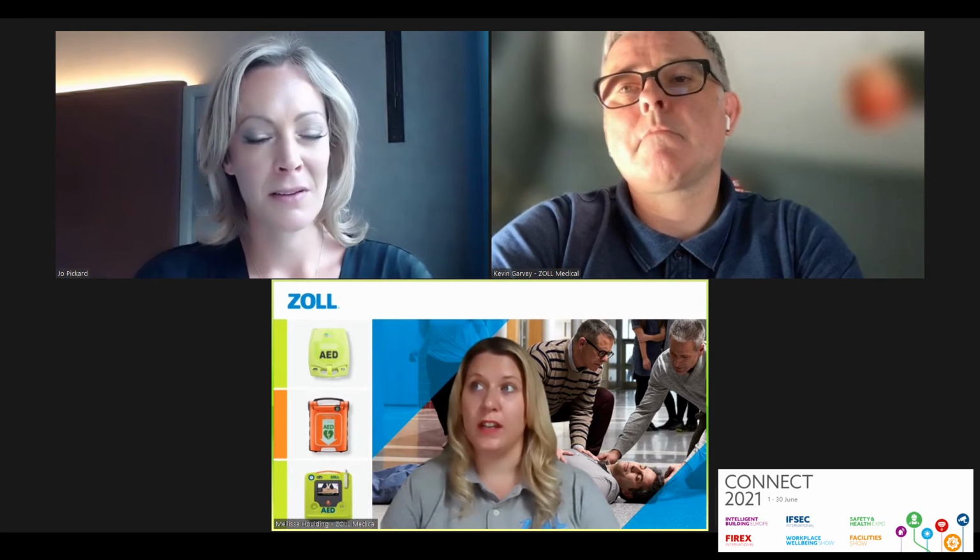When we're talking about servicing, that's usually if something is actually going wrong with the device, and the unit will tell you that there's something wrong, and then you can get in contact with the likes of ZOLL, for example, or a business partner that you may be working with, who can arrange to come and ensure that the device is fit for purpose. In terms of the AED3, it conducts self-checks once a week on a Sunday at 3:03, to be precise.